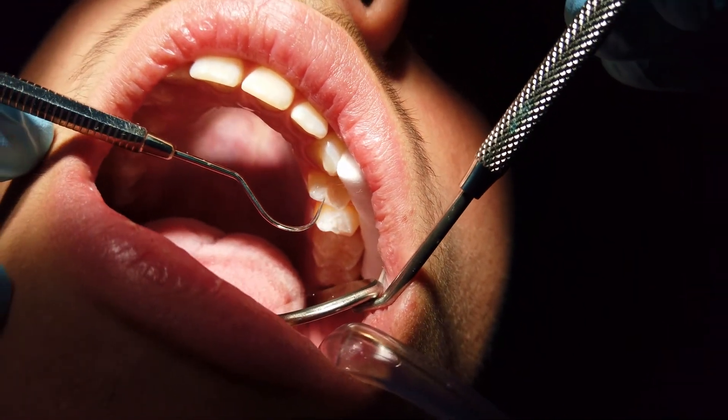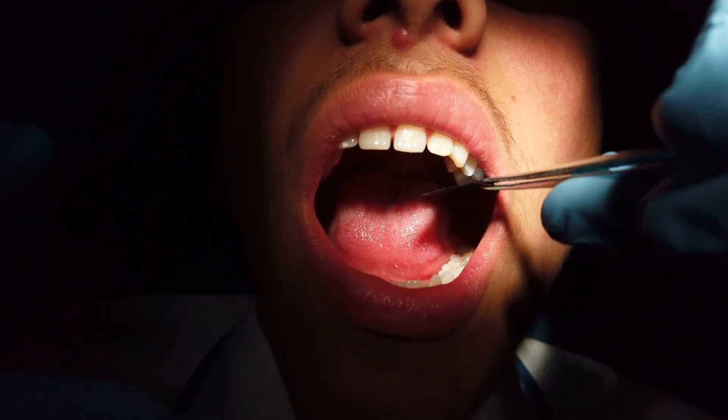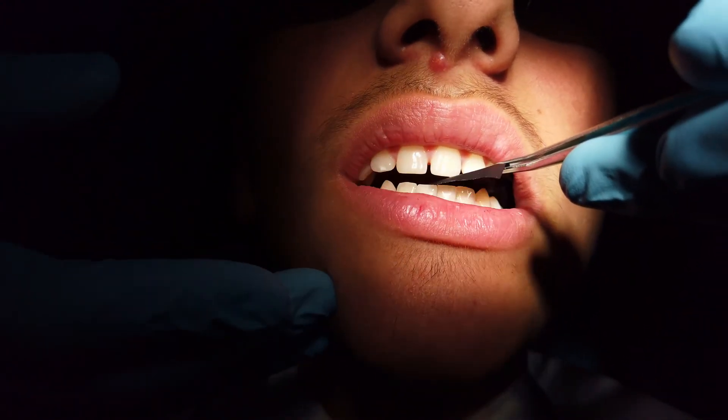Finally, we check the bite in order to ensure there is no discomfort to the patient, and that completes the procedure. Overall, the sealants are a simple and effective means to reduce tooth decay. There are no common risks or complications associated with fissure sealing.